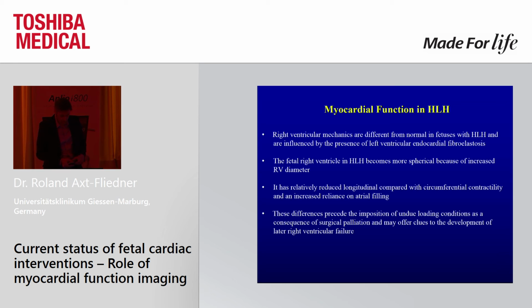So one has to be very cautious about this, but speckle tracking is also there, probably a good tool to evaluate myocardial function.